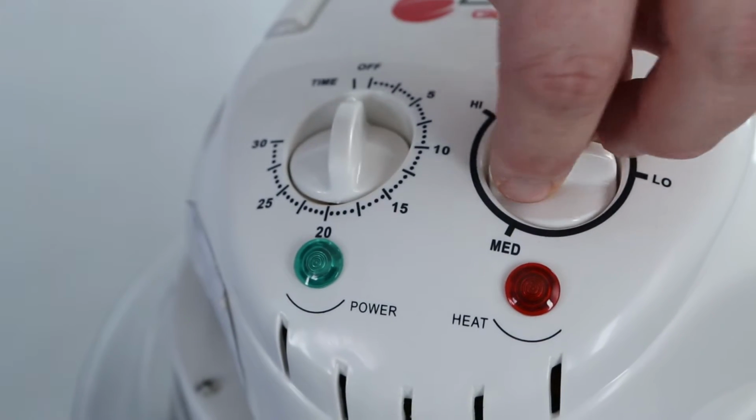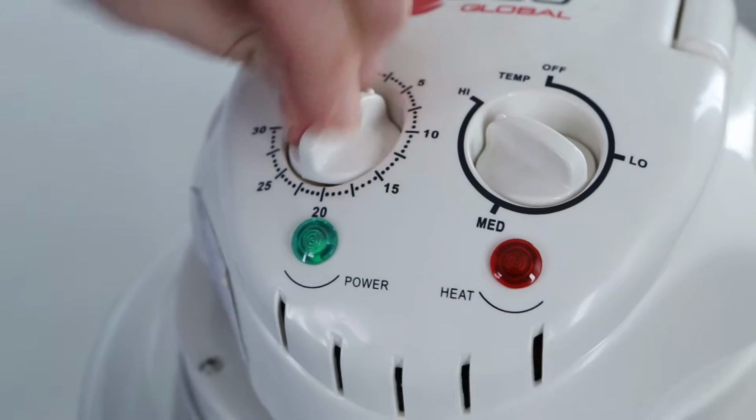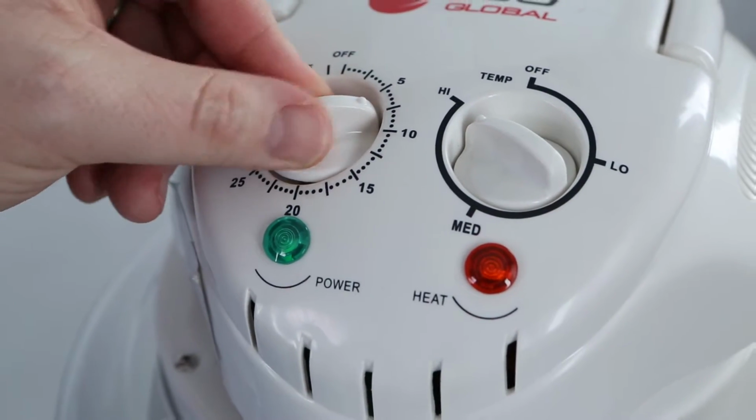Now we're ready to start the timers. Set the oven temperature to high for 7 minutes. Start your stopwatch.